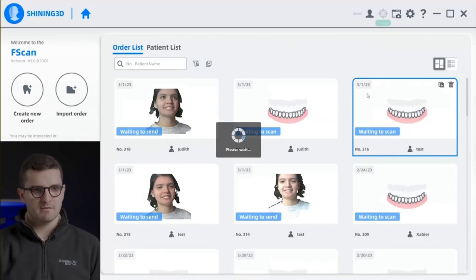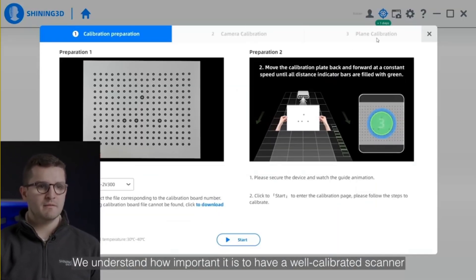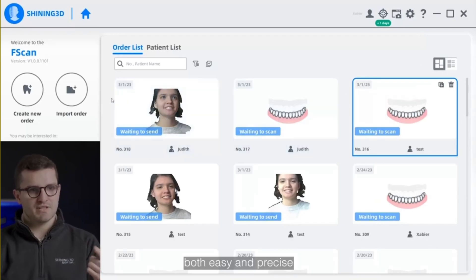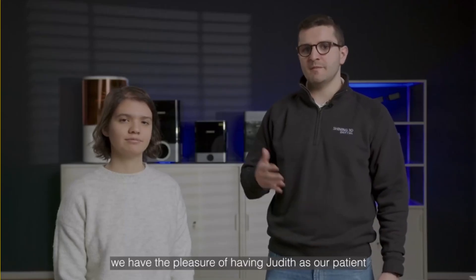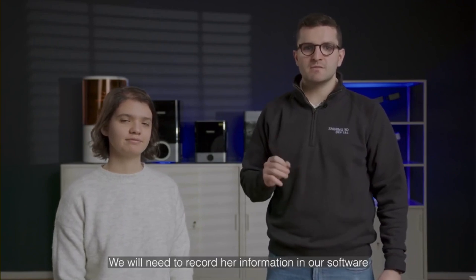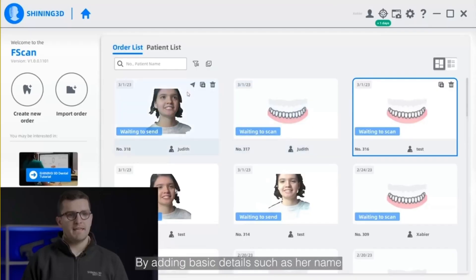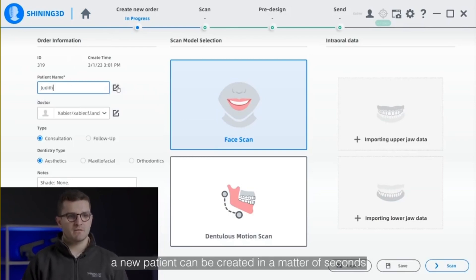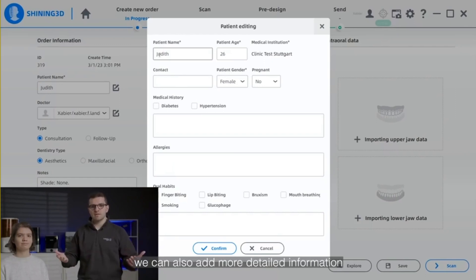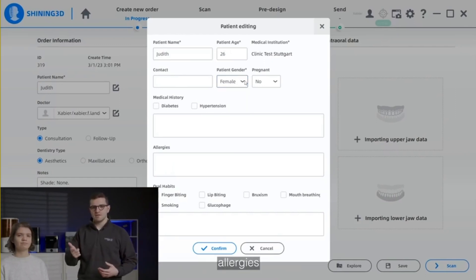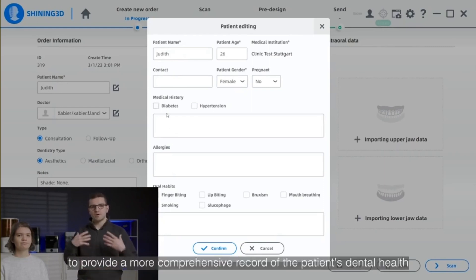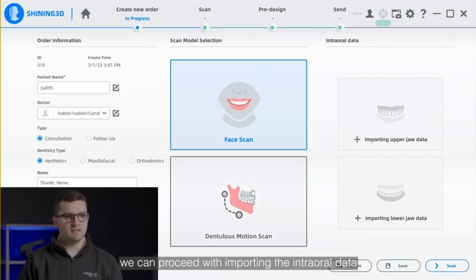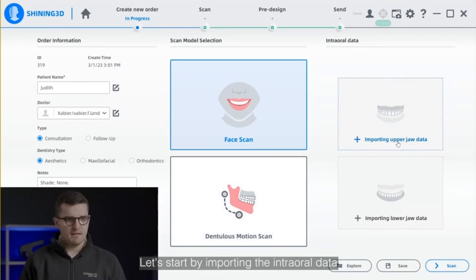The calibration button is located in the upper right corner and it will turn red when a new calibration is required. We understand how important it is to have a well-calibrated scanner, and that's why we have made the calibration process for Metismal both easy and precise. Today, we have the pleasure of having Judith as our patient. To get started, we'll record her information in our software by adding basic details such as her name, age, and gender. We can also add more detailed information such as medical history, allergies, and oral habits to provide a more comprehensive dental health record.